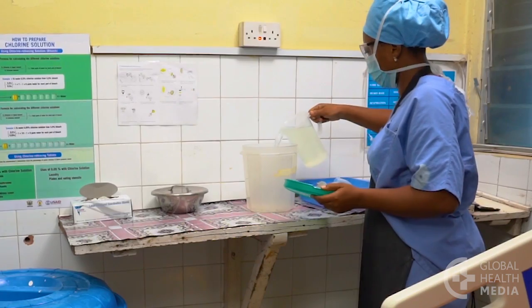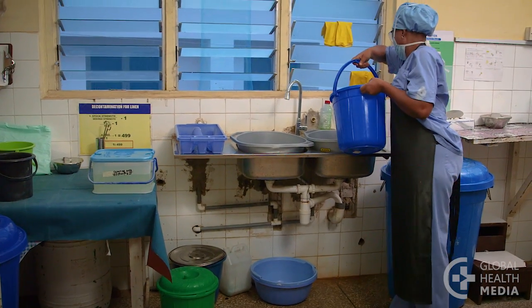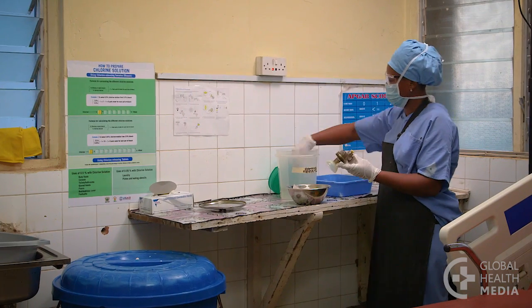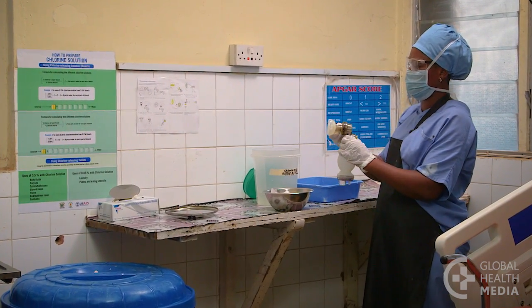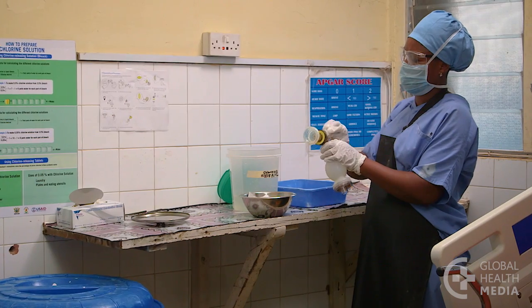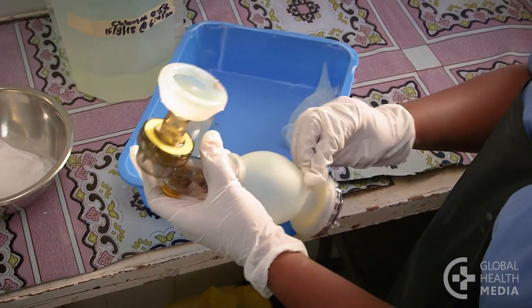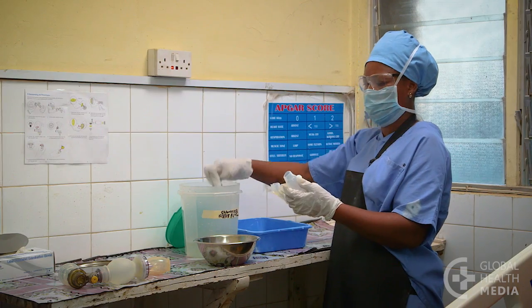Prepare a solution of 0.5% chlorine and soapy water fresh each time you need to clean the equipment. Next, wipe off the equipment right after use. This step makes cleaning easier and safer by removing secretions before they harden on the equipment and removing harmful germs such as hepatitis or HIV. Dip a piece of gauze in your solution of chlorine and wipe all the surfaces on the outside of the equipment. Re-soak the gauze when you start on a different piece.